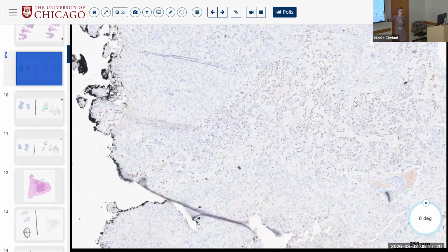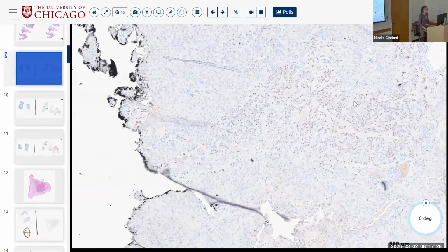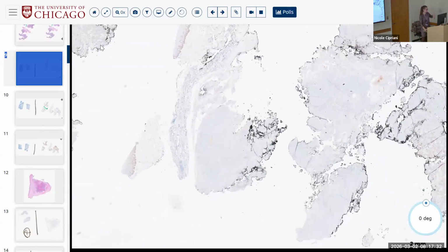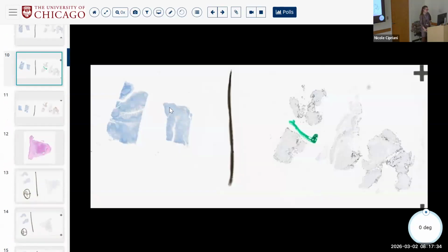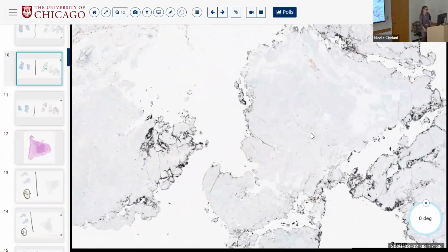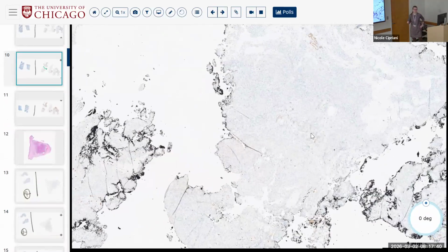It's a very complex architecture, right? You wouldn't expect non-neoplastic ducts to have this ramifying structure, right? So these are probably neoplastic ducts. So now you're dealing with a biphasic tumor, exactly.